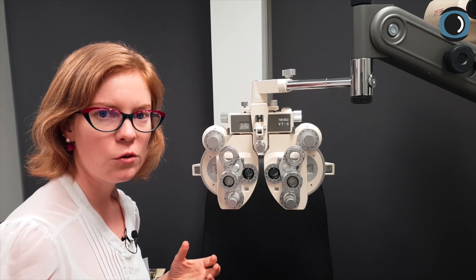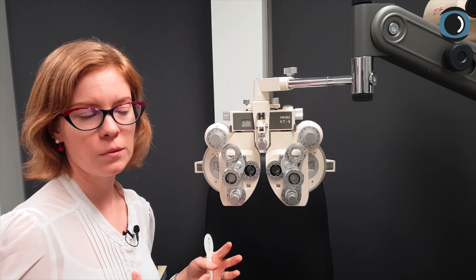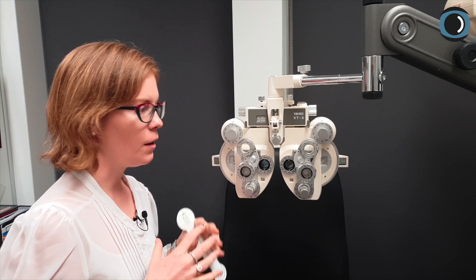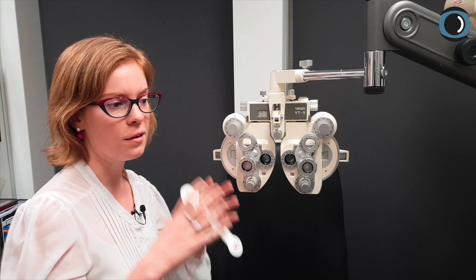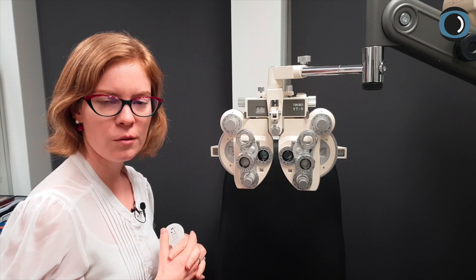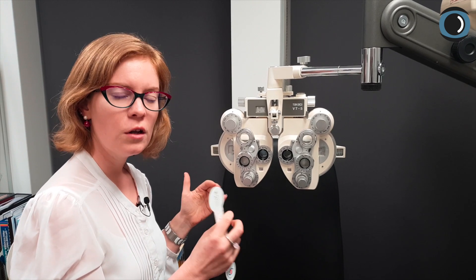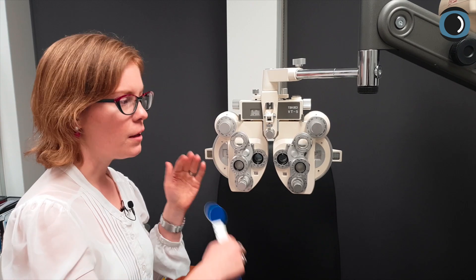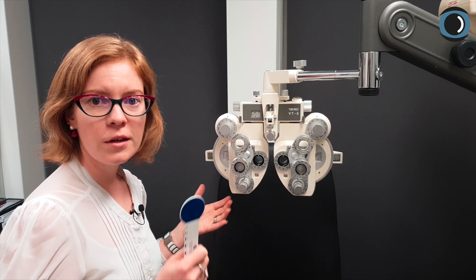This is a really good way to get extra plus out of people, particularly presbyopes. These cases are also a little more pitched towards myopia, and subjective refractions for myopic kids can be quite difficult. If you are doing a lot of subjective refractions with kids and young myopes, this can be a really useful tool — first, to make sure you haven't over-minused one eye, and second, to ensure you're getting to the maximum plus for them.